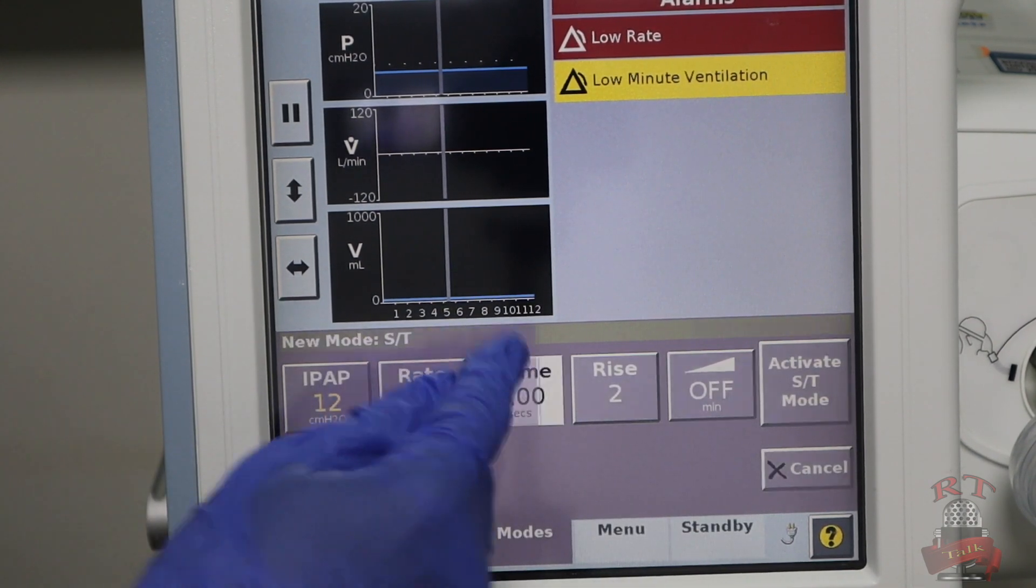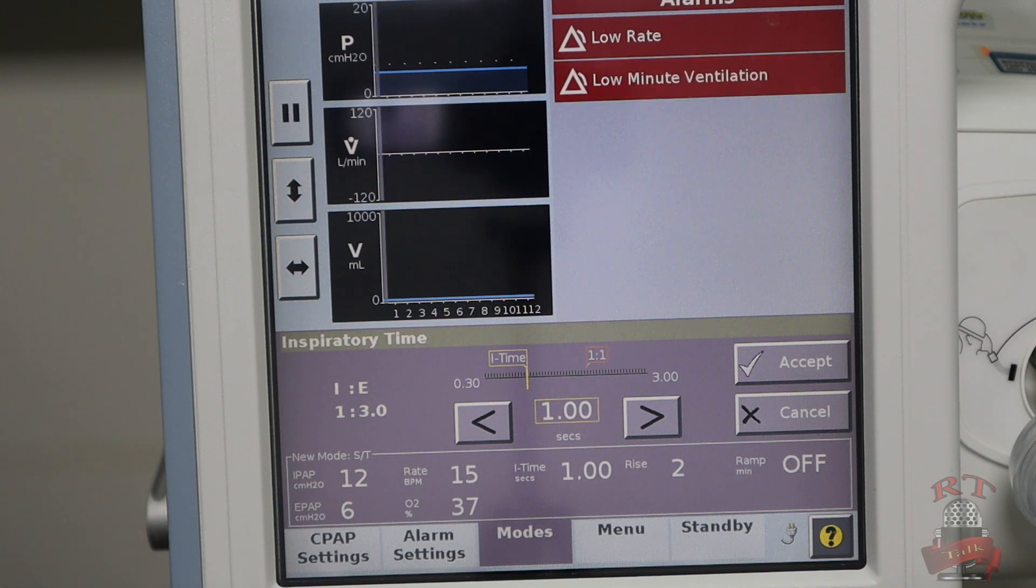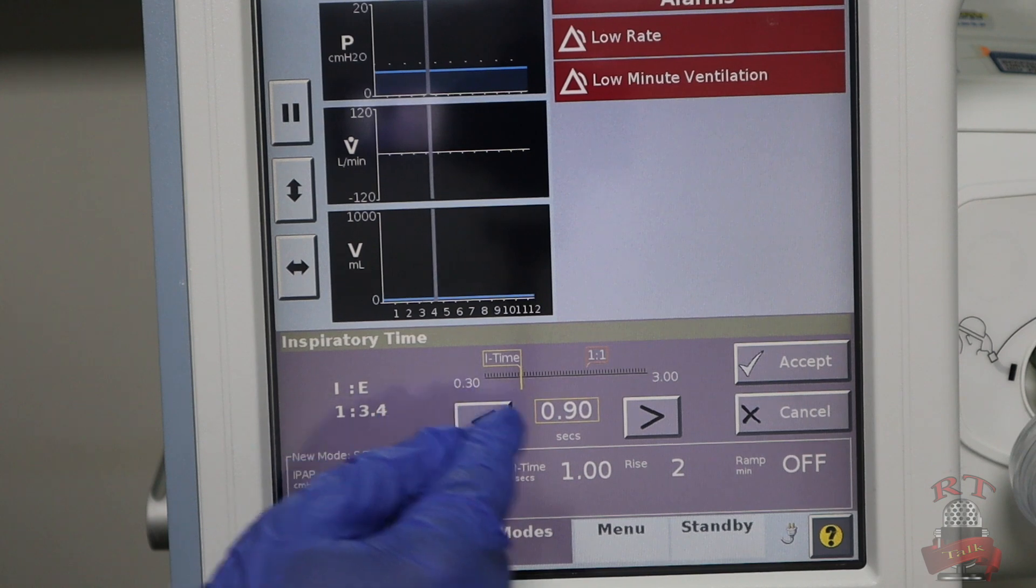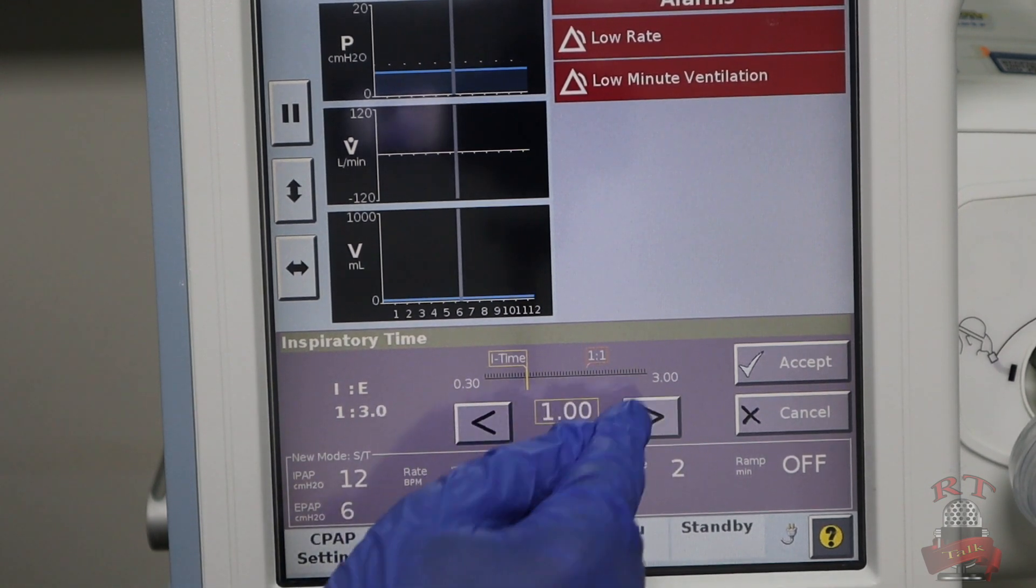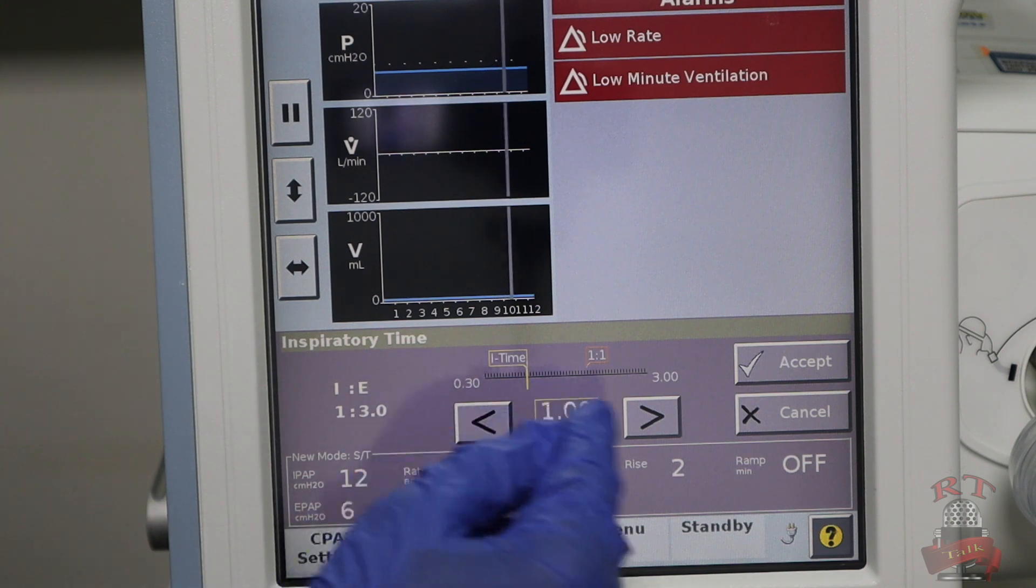Then the inspiratory time: for pediatric is from 0.6 to 0.8, and for adult is from 0.8 to 1.2. For me, let's say I'm dealing with adult. I will keep it at 1.0.